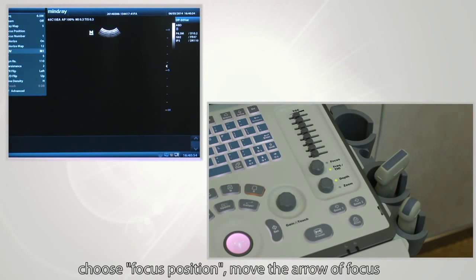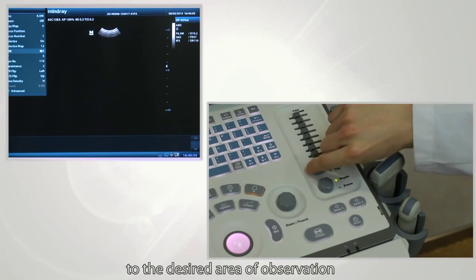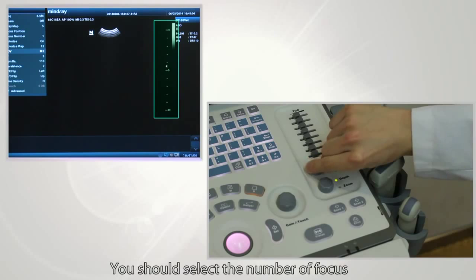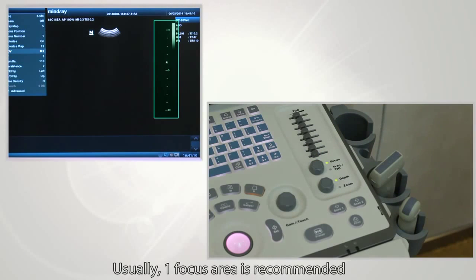Next, adjust focus. Choose the focus position and move the focus arrow to the desired area of observation. The focus area is the area you want to see most clearly. Select the number of focus areas and their positions — usually, one focus area is recommended.